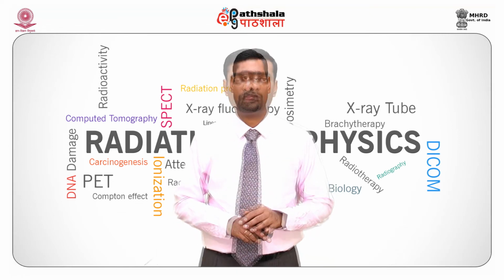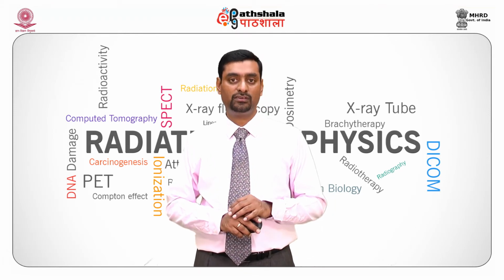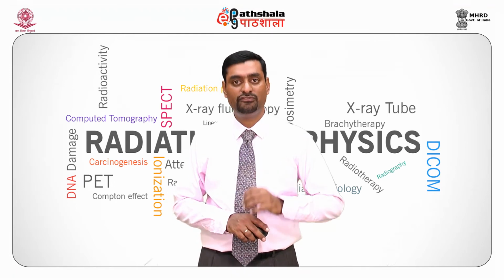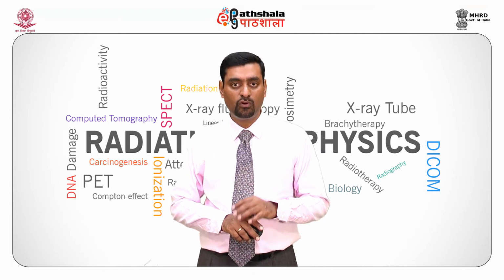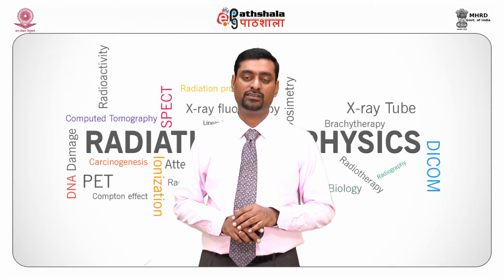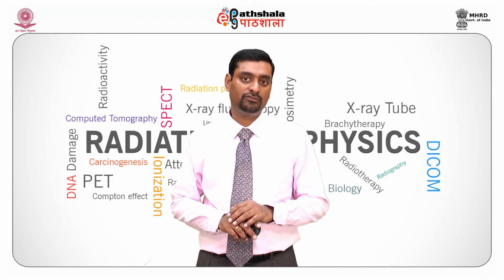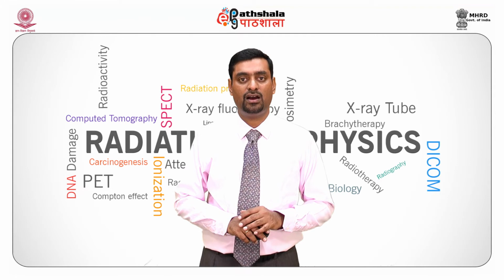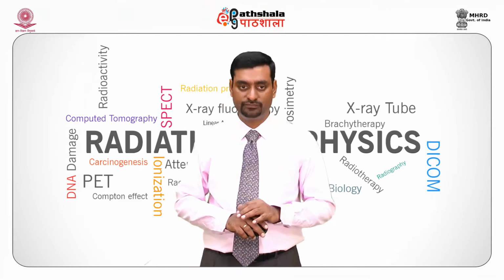In the dark room, manual or automatic processor is placed, and in dark environment, a radiographer opens their cassette, removes the film and feeds it into the automatic processor or holds it into a holder and tries to agitate within the developer. So everything is happening in a dark environment except a safe light is present about 4 feet above the bench where all the processing chemicals are present.